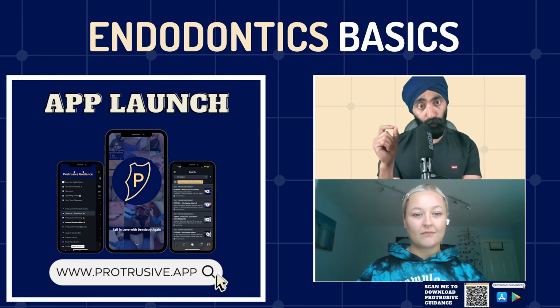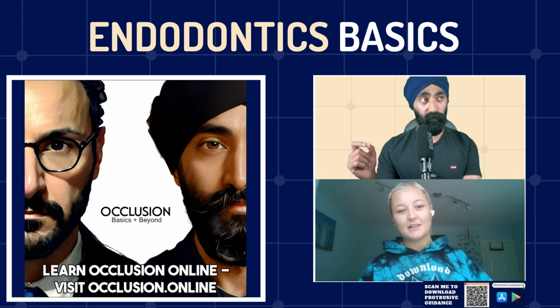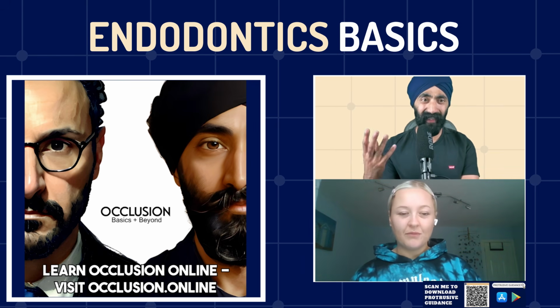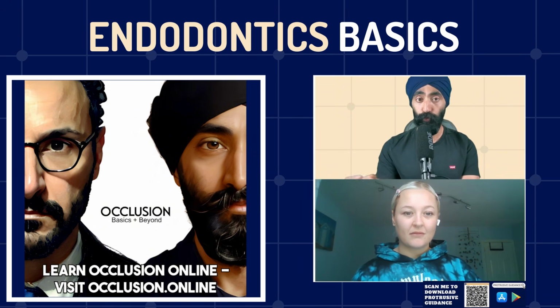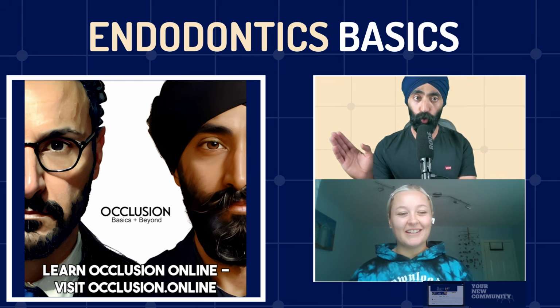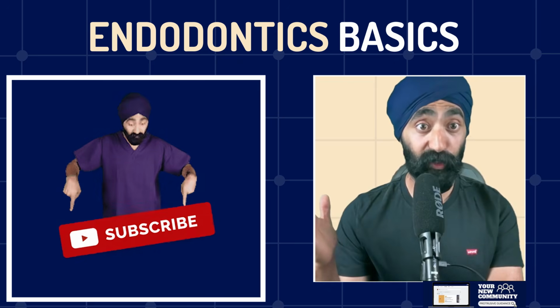Have you seen silver points before? Before they used Gutta-Percha, there were these silver points in canals. They have a classic look, a super radio-opaque point in the canal, and they're really short, usually short of the apex, and there's no infection around the tooth.